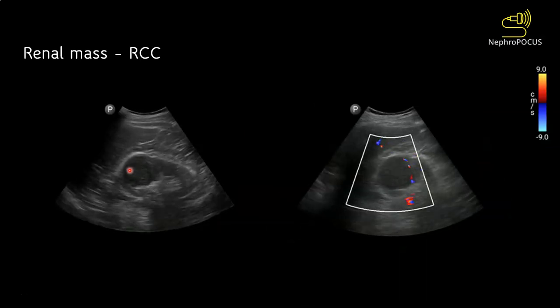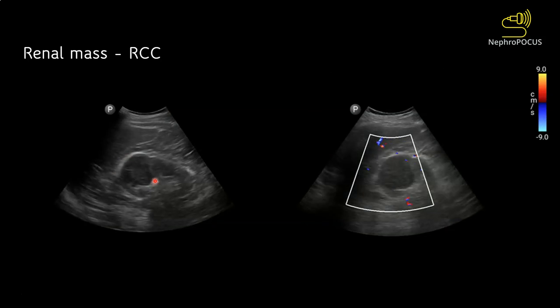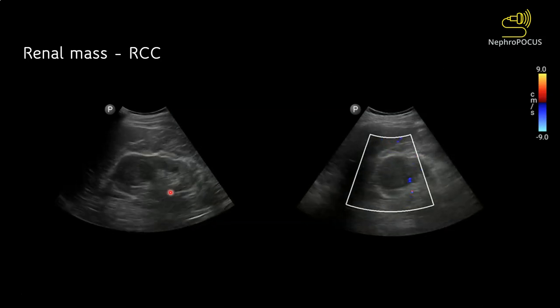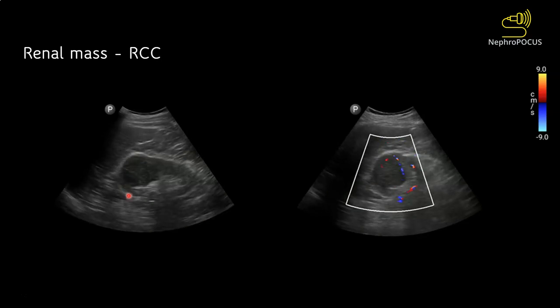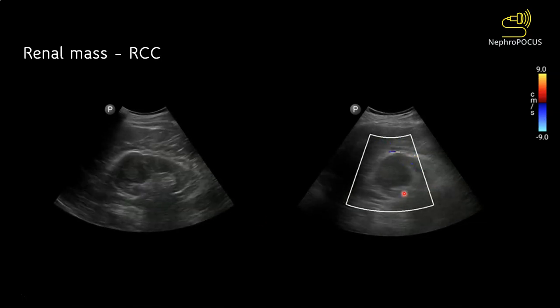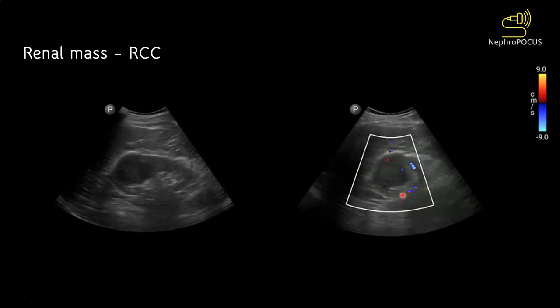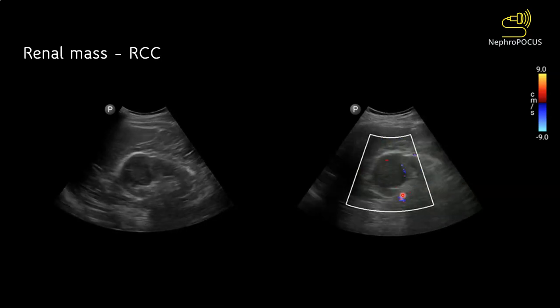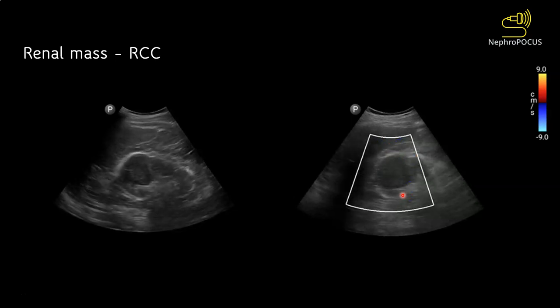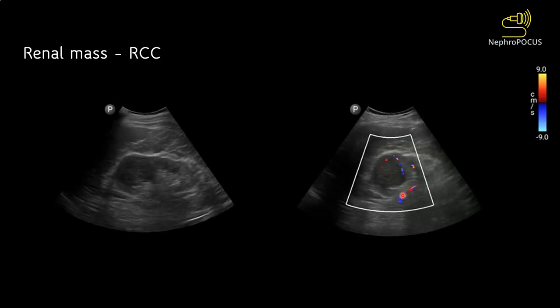Here is another example where you can see a hypoechoic mass growing outside and the kidney outline is disrupted. Here is the color Doppler image of the same mass showing the distribution of color in the periphery of the mass. This is an important feature to distinguish a true mass from a pseudo-mass such as a dromedary hump in the left kidney or a hypertrophic column of Bertin.